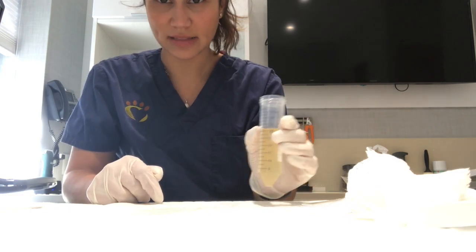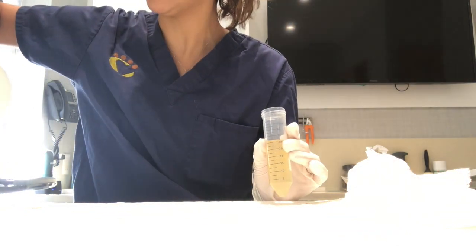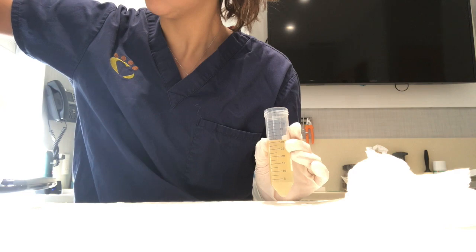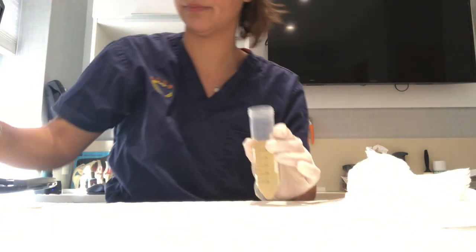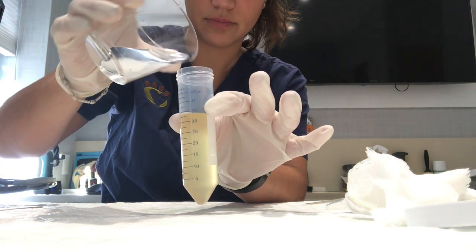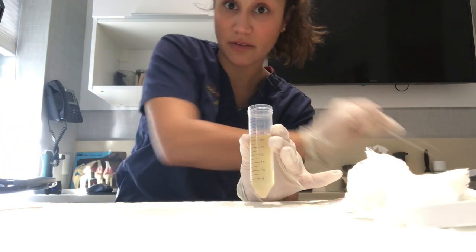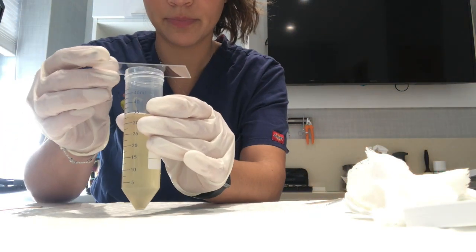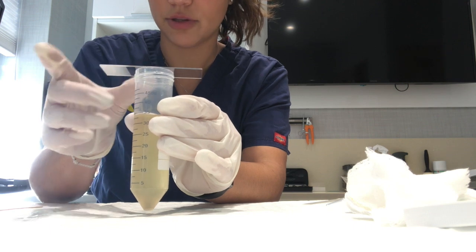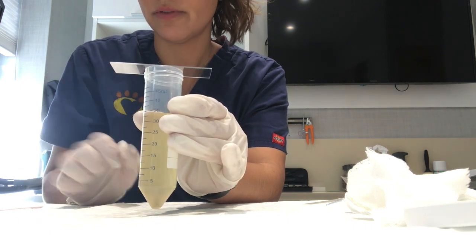Okay, now I'm just going to add some fresh solution to the top just to form a meniscus. So I'm just going to pour it from my big container into my smaller container. Just a little bit. Good. And now I will place the cover slide on top, just like this. Now I'm going to leave it to sit undisturbed for 10 to 20 minutes.